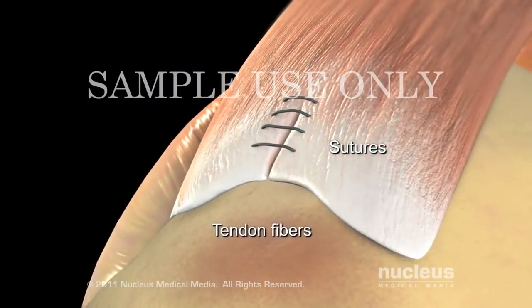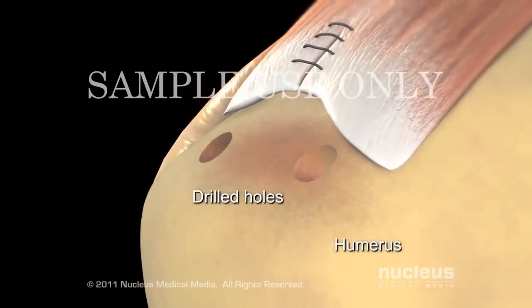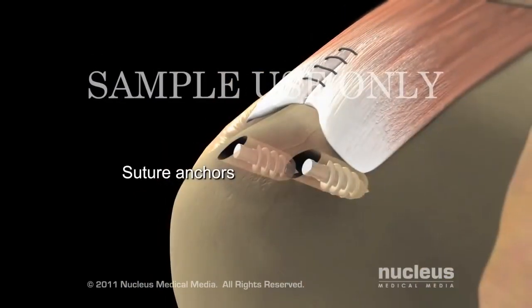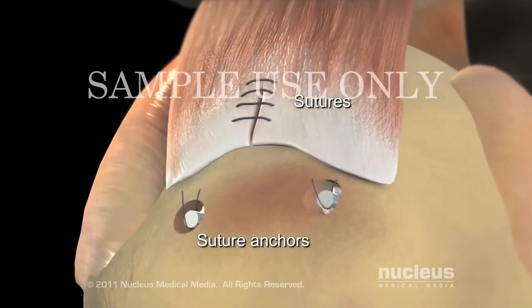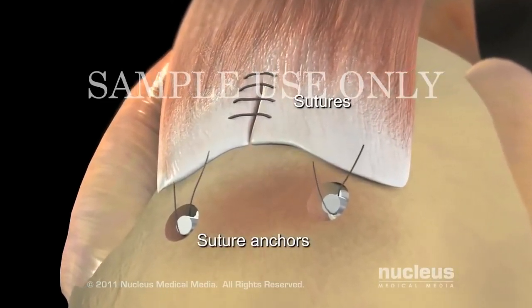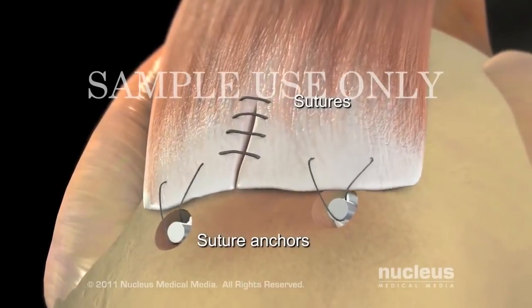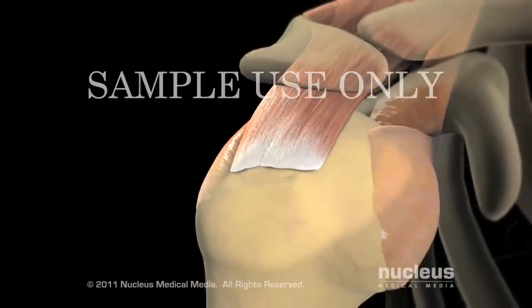Next, your surgeon will drill a few small holes in your bone wherein implants, called suture anchors, will be placed. Your surgeon will loop sutures through the anchors and stitch them to the repaired tendon to reconnect the tendon to the bone. The anchors and sutures will gradually be absorbed into the healing tissues.